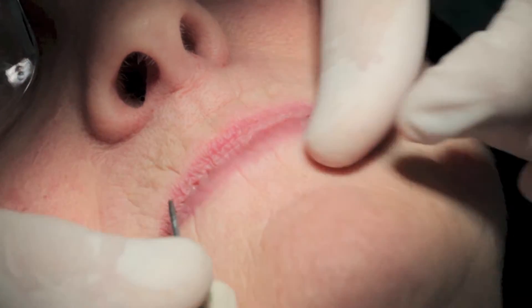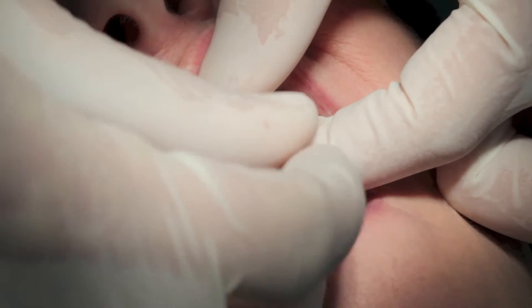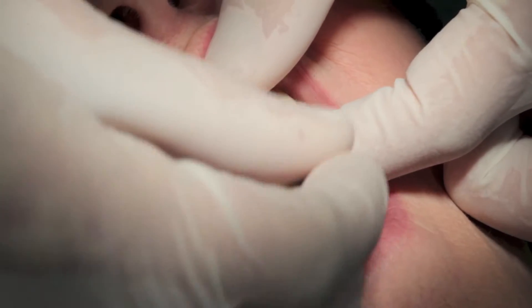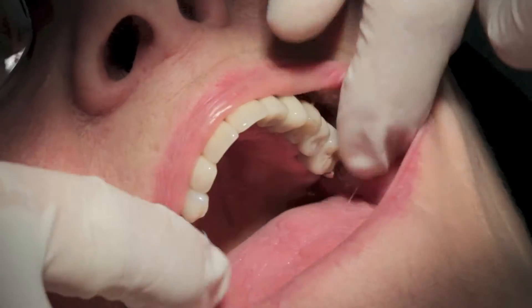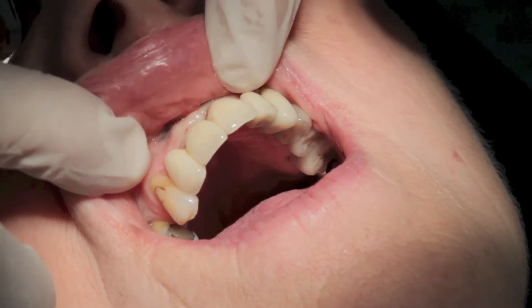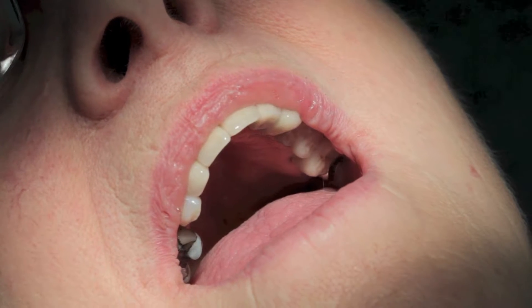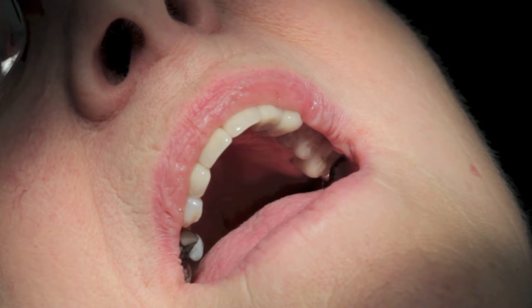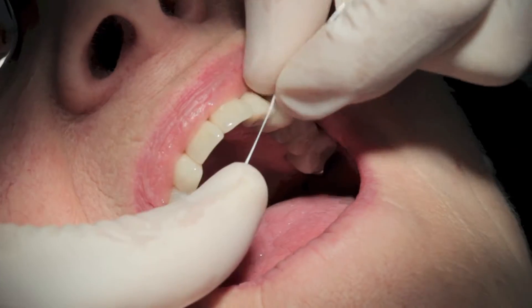How are we doing down there? Not too bad. The teeth feel a bit wrong — they haven't quite got them down yet. Now as we're tightening the screws we're being aware of the tissue but also the contacts with the teeth either side. You have to floss over here, because if the contacts are heavy that will prevent the implant bridge from fully seating.